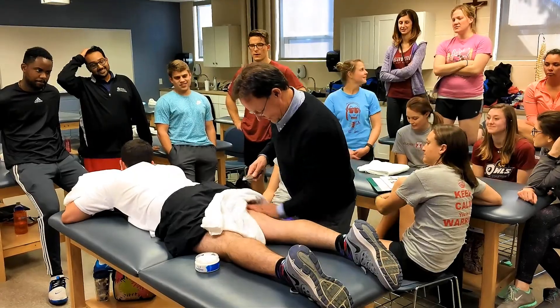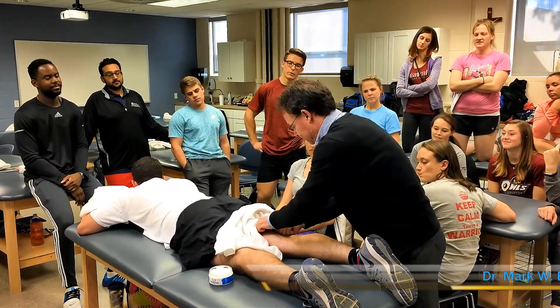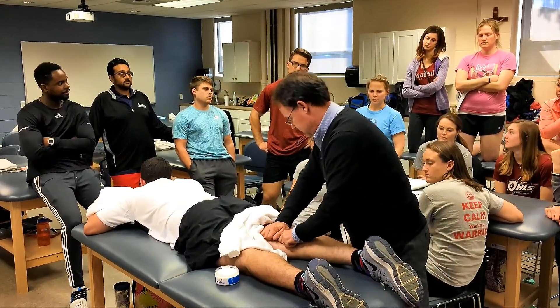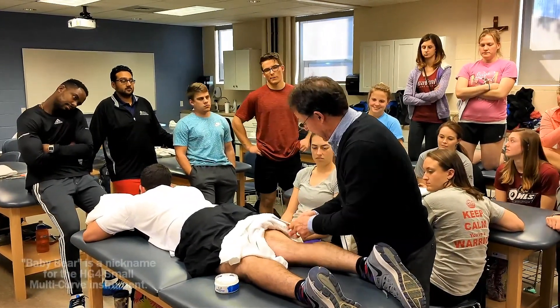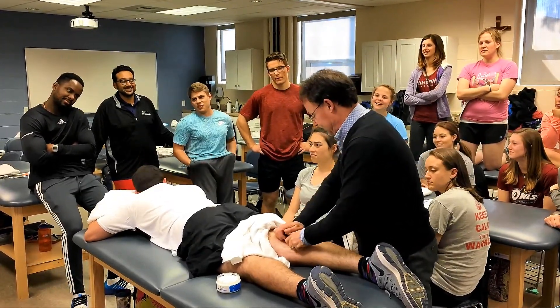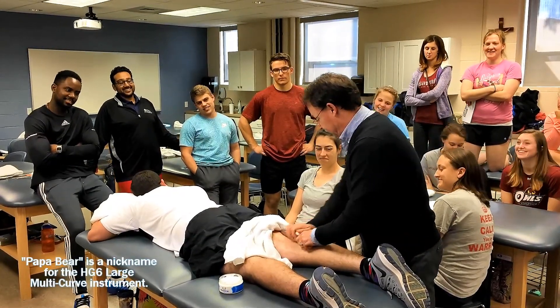You're not nervous yet, are you? You don't have to spend a whole lot of time and we should be able to get a whistle. The Baby Bear is going to be for the hand, maybe the foot. The Papa Bear is going to be for the thighs — someone with a pretty large forearm or up around the biceps.